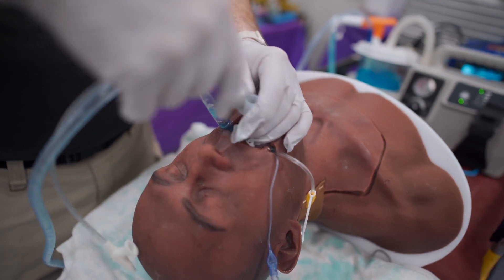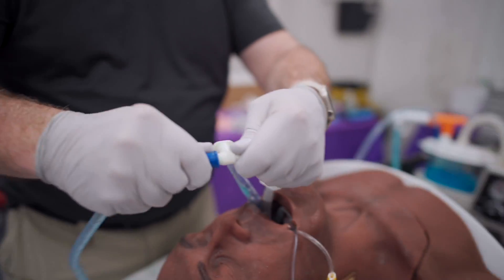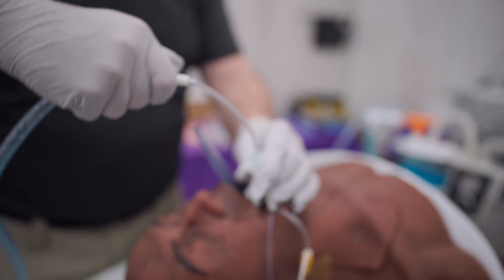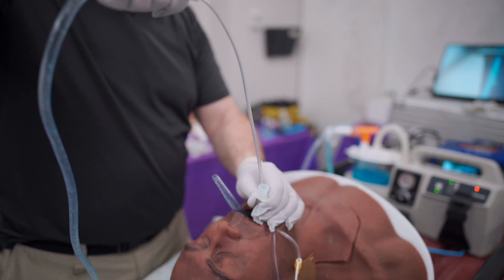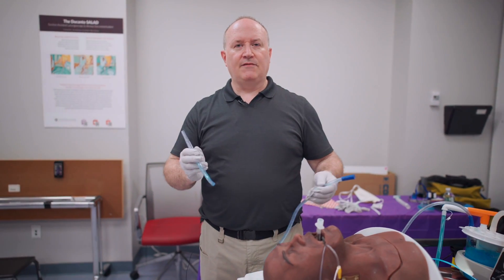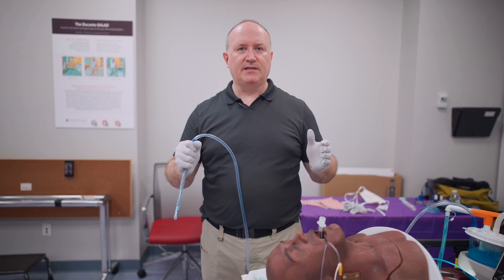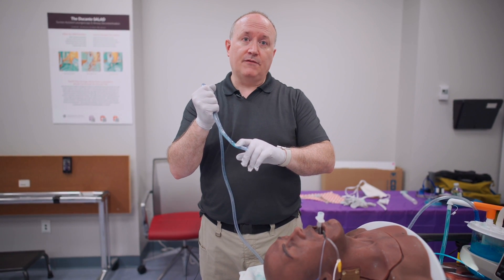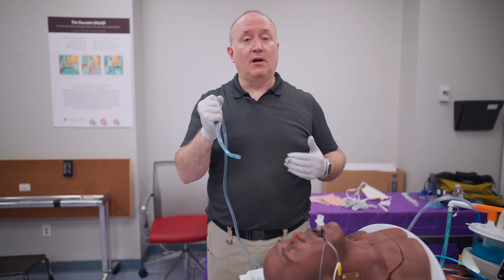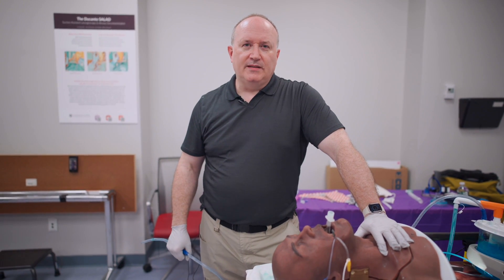I'm leaving the suction catheter parked in the esophagus as I connect the flexible suction catheter, occlude the vent control hole, and withdraw the catheter under suction while securing the tracheal tube to the patient. The summary of this technique is that the suction catheter, aside from removing airway contaminants, can assist the practitioner in basic and advanced airway management by physically distracting the tongue into the floor of the mouth, distracting the mandible inferiorly and anteriorly, lifting the base of tongue off the posterior pharyngeal wall, and elevating the epiglottis — which simplifies the insertion of supraglottic airways. Thanks for spending a few minutes with me — this is Dr. Jim Ducanto signing off.